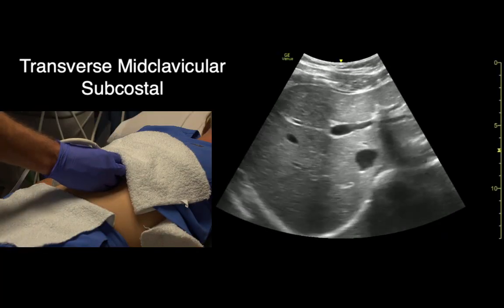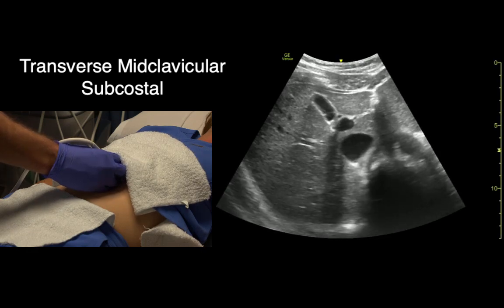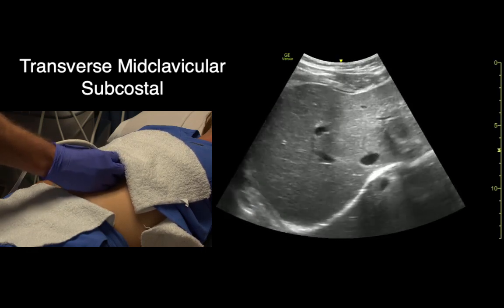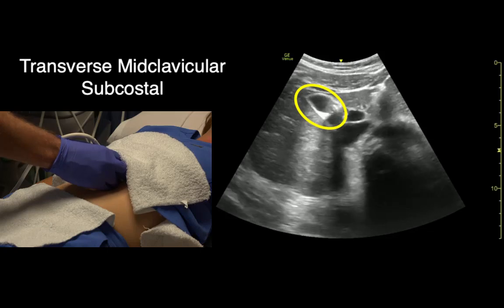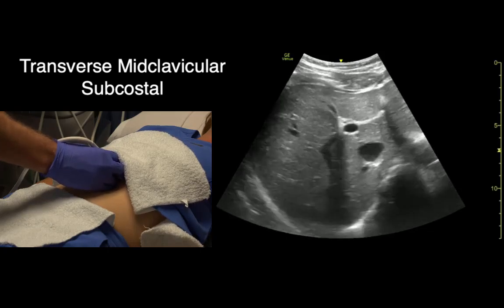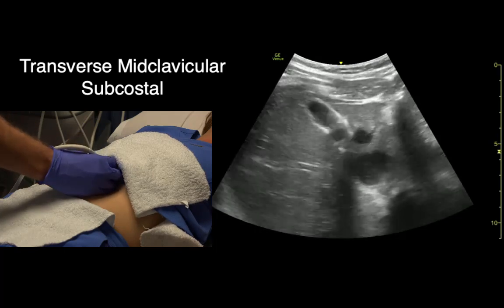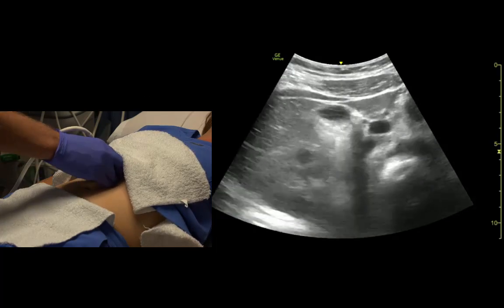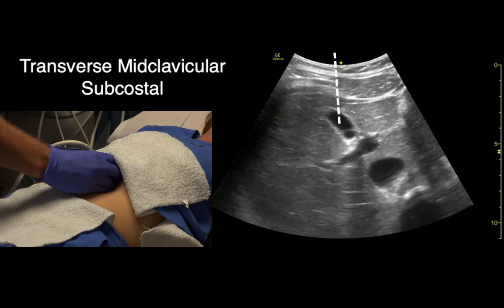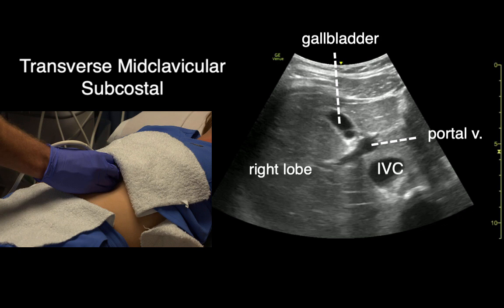Rotating counterclockwise and fanning down towards the feet, the gallbladder comes into view — her gallbladder has a little fold. The gallbladder is also a landmark to divide the right and left lobes of the liver.